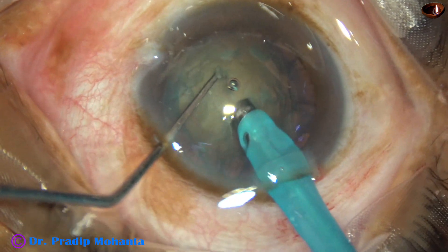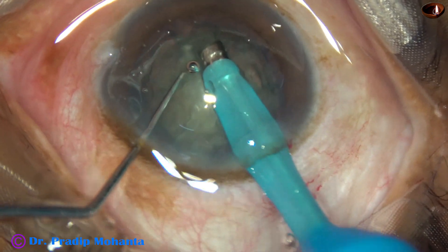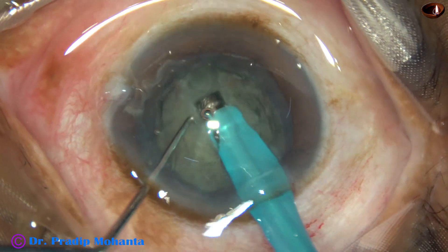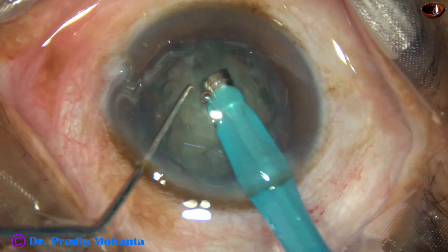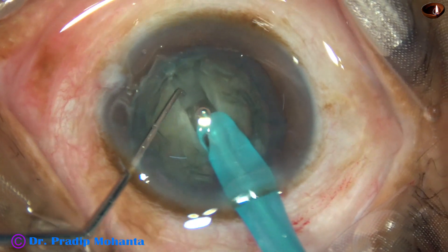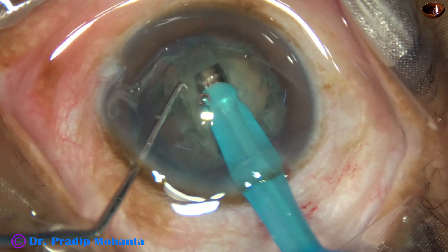Sculpting is started from just in front of the main wound and it goes towards the opposite equator. The trench is deepened at the center and sculpted just under the capsulorhexis margin.